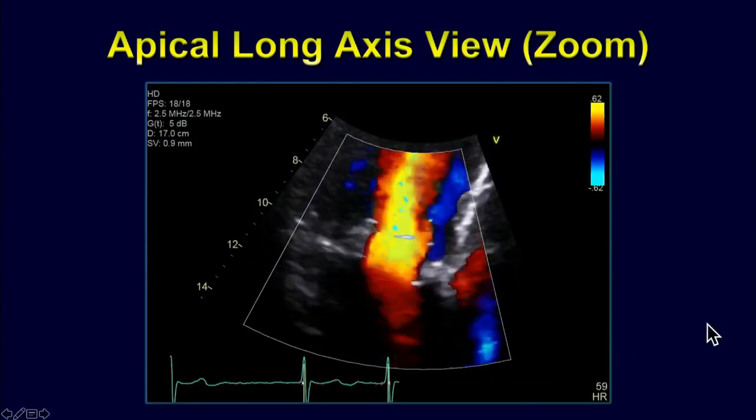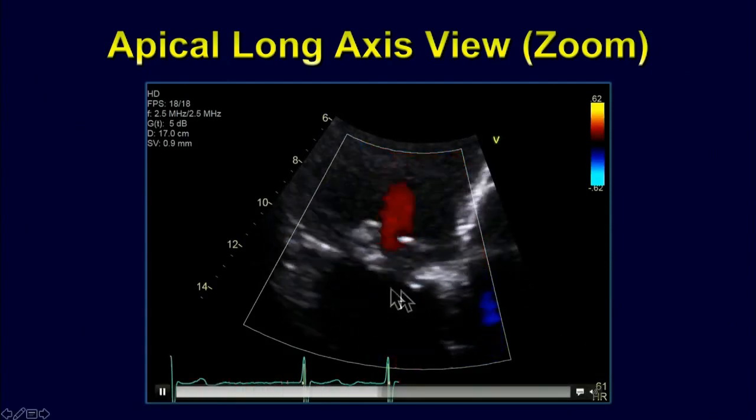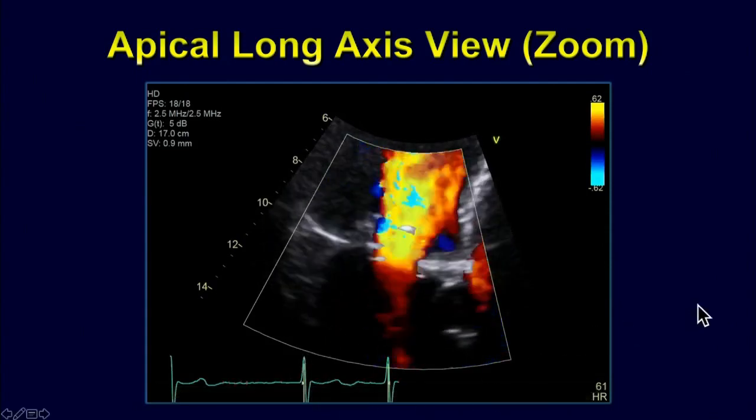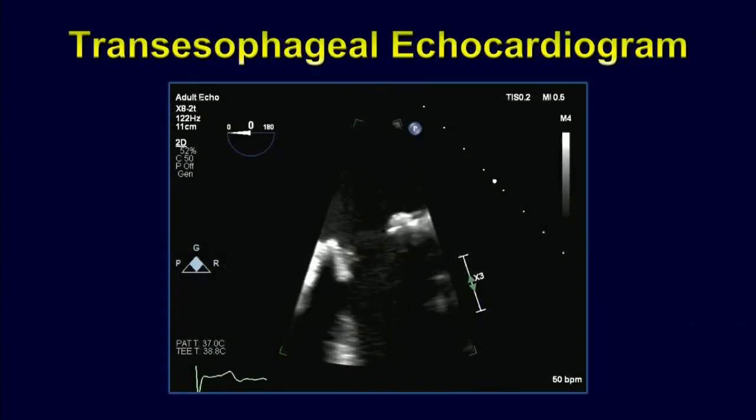I wonder, Superman can't look through steel, ultrasound can't look through the prosthesis, and therefore maybe we're missing this, but the TVI ratio is high. We need to explain that if measured correctly. So this patient went on to have TEE.